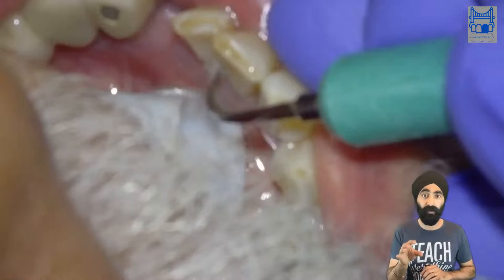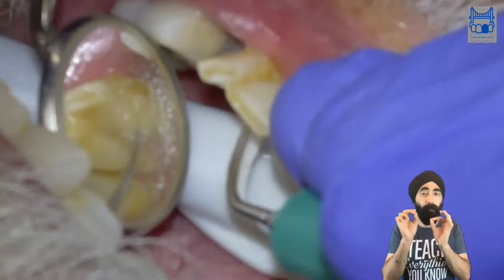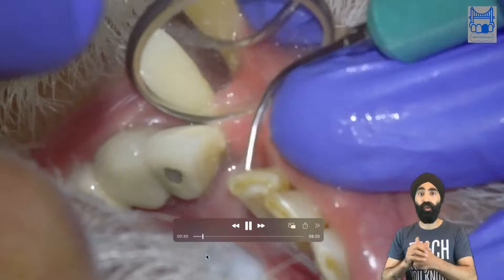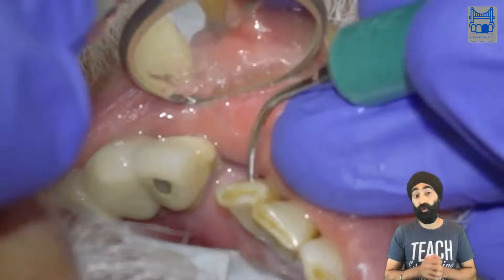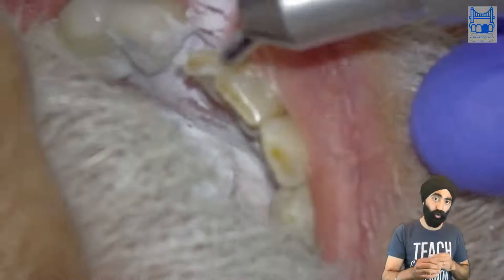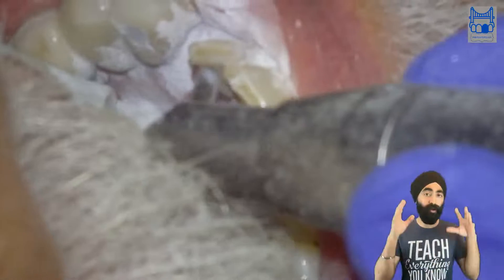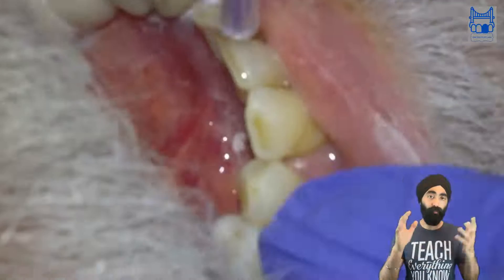This was an 80-year-old gentleman, and I think there are some features of this resin bonded bridge that aren't amazing — we'll talk about that shortly. First things first: clean the tooth thoroughly. I've got my ultrasonic scaler, I sometimes even use Softlex discs, and I air abrade the tooth. I don't care if it gets a bit messy — the tooth must be air abraded. I'm not going to put on rubber dam just for this bit because it's very quick and easy with a tolerant patient.